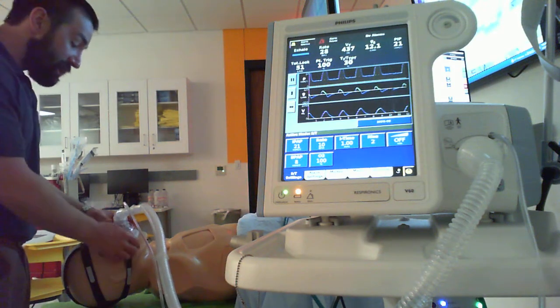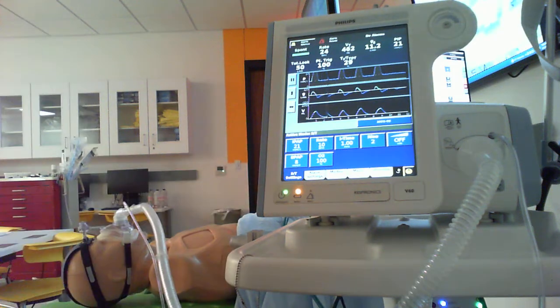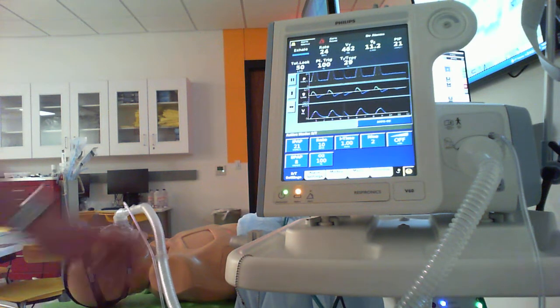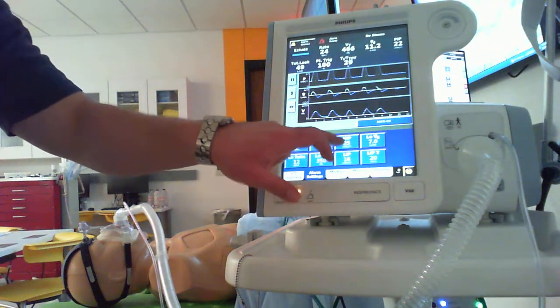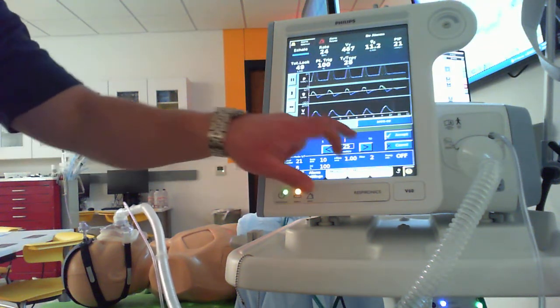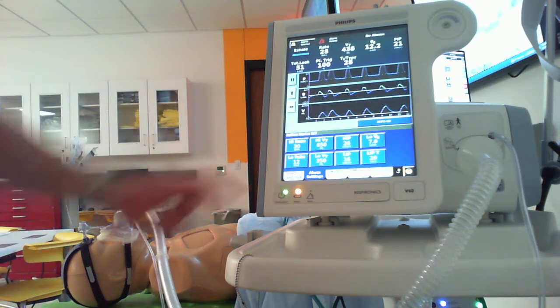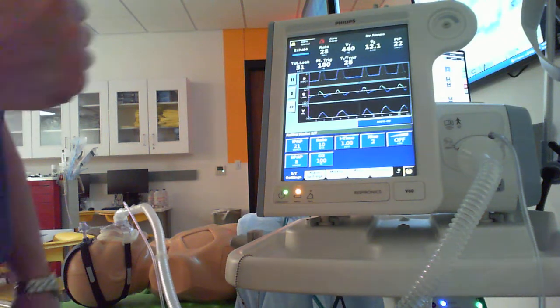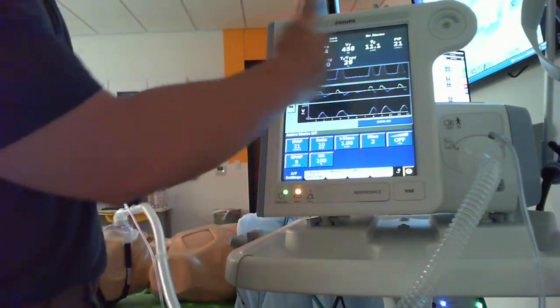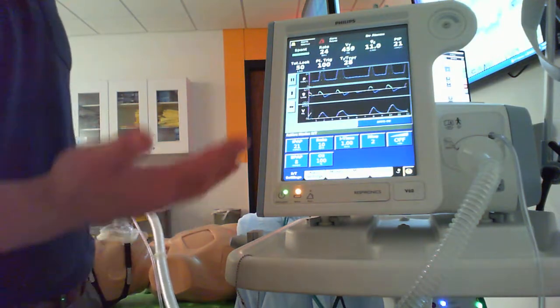If the patient was doing okay with it, I'm reaching my pressures, everything looks good, I could maintain the course there, okay? I could reevaluate my alarms. I'm still technically okay, but if you wanted to set it just a little bit higher, something like 5 above, you could. At this point, we would do a full patient assessment. All right, we document all of our findings up here, all of our settings, and go from there.